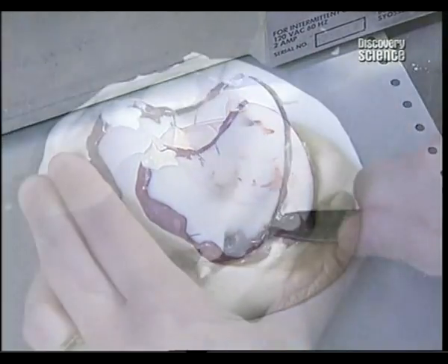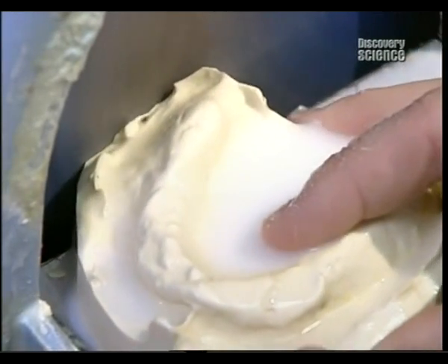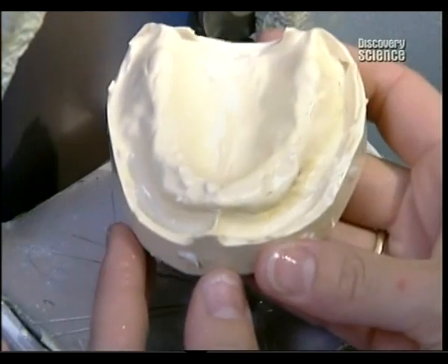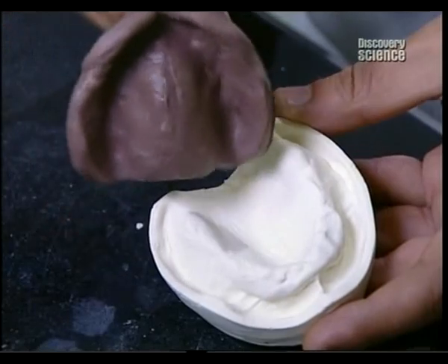The lab uses the hardened rubber as a negative mould of the patient's mouth. The mould is filled with plaster to make a new, more precise model. The new model is used to make the part of the dentures that fits on top of the patient's gums.